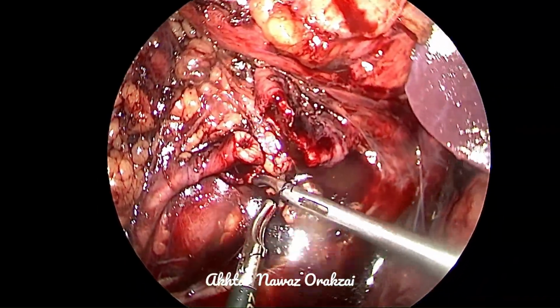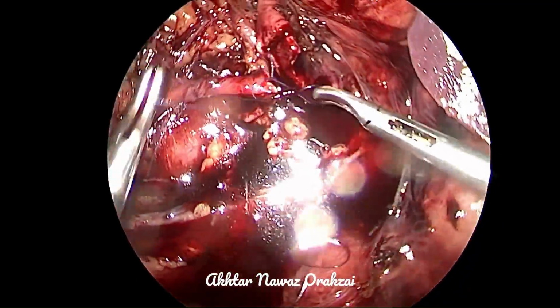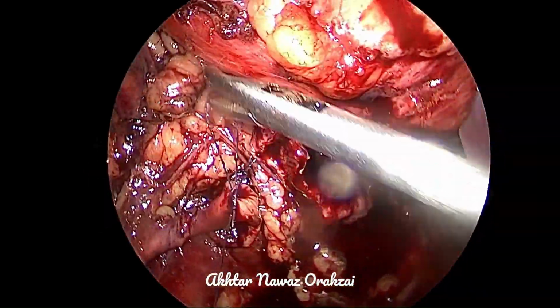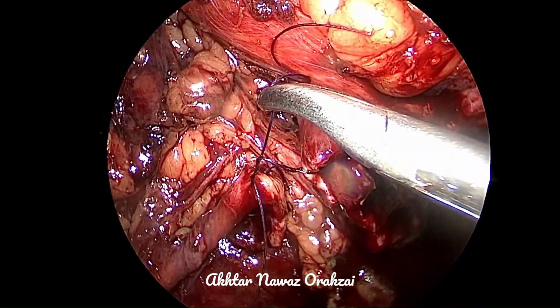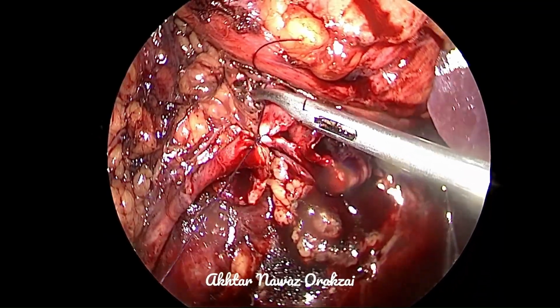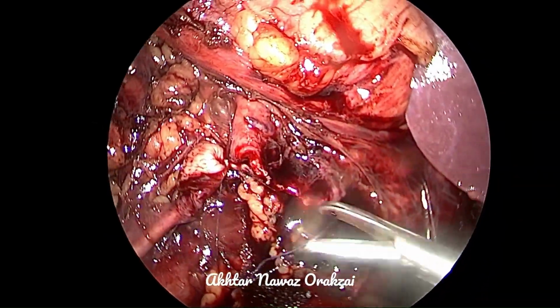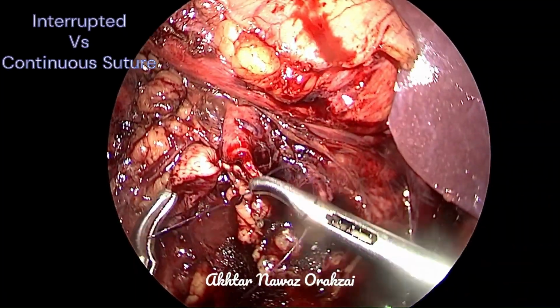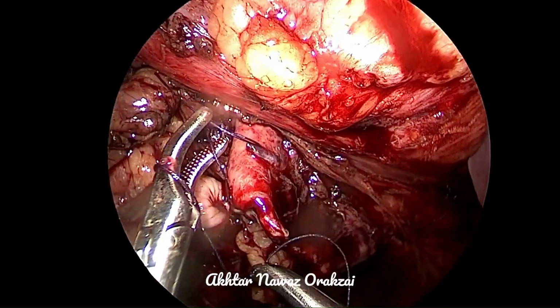So mobilizing more of the ureter leads to more ischemic injury. These are factor number 3. And factor number 4 is after anastomosis, when we leave the ureter and the pelvis goes towards the renal hilum, so it gets stuck to the lower pole.